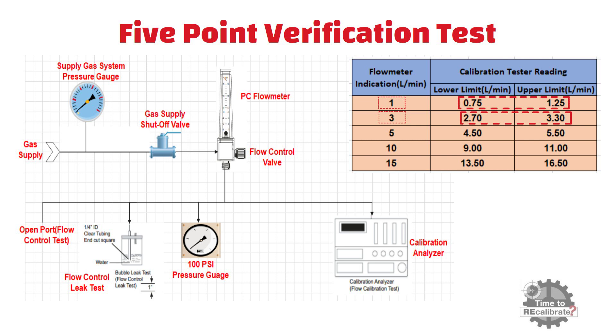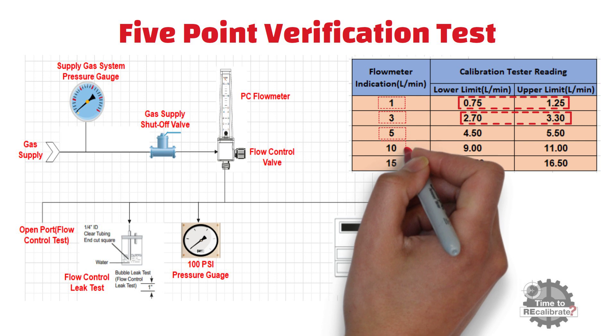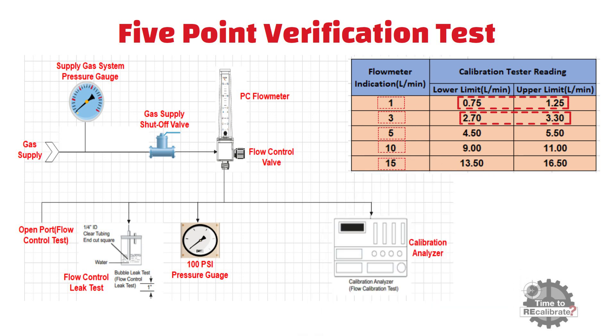After this, repeat the same steps by setting the flow rate to 5 and 10 liters per minute, and record the values from the calibration analyzer. At the end, set the flow rate to 15 liters per minute and verify the flow rate with the calibration analyzer — it should be between 13.50 and 16.50 liters per minute. If the flow rate is not within this range, the calibration test has failed for that oxygen flow meter, indicating there is some issue with it.